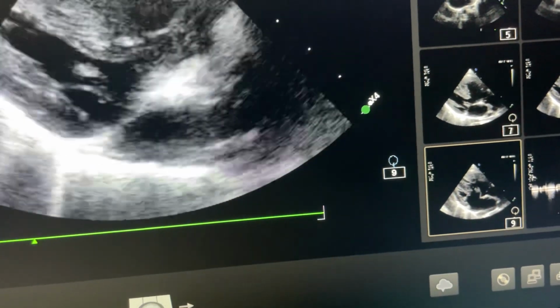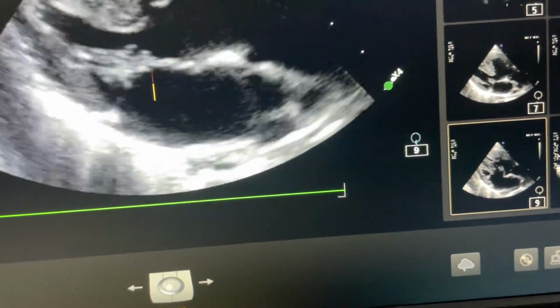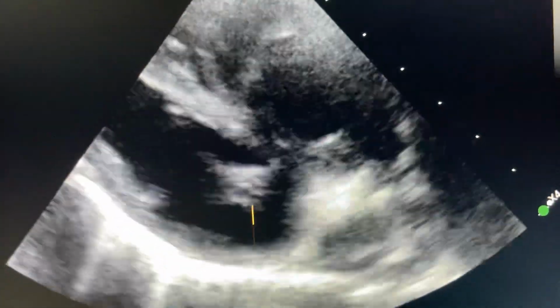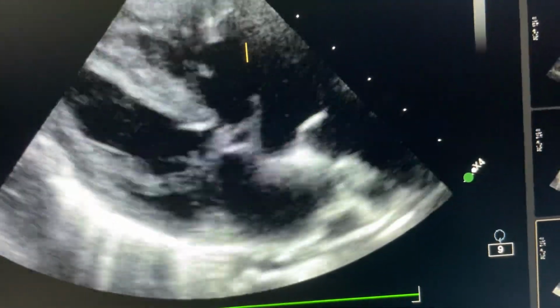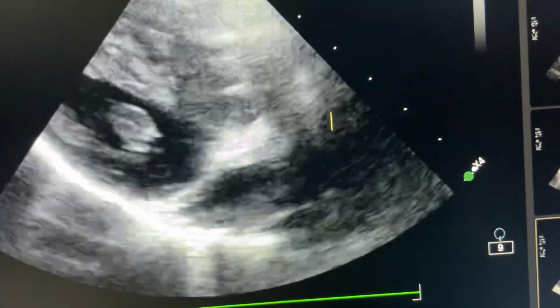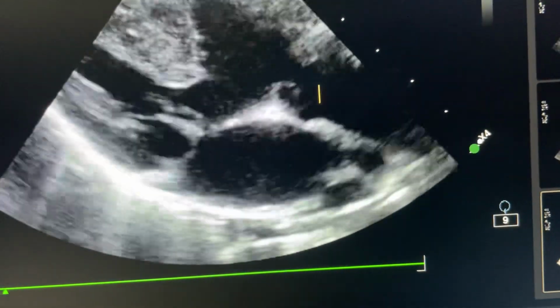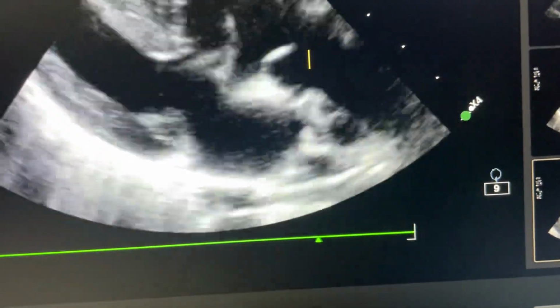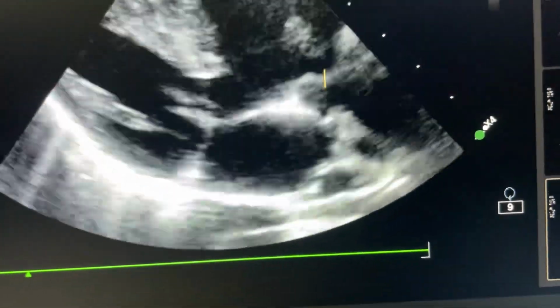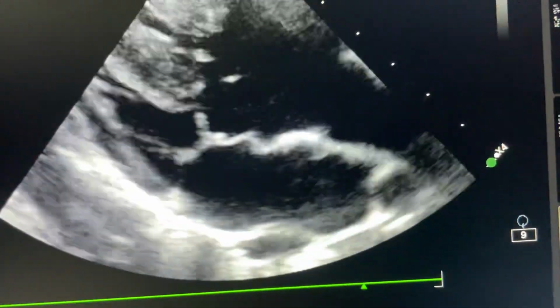Again, next image. This is left atrium, left ventricle, this is right ventricle. From right ventricle, aorta and then pulmonary artery. Pulmonary artery has severe valvular obstruction, hypoplastic main pulmonary artery, and hypoplastic pulmonary artery branches also. So right and left pulmonary artery are also of small size.